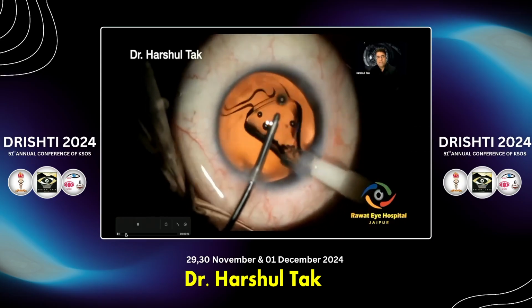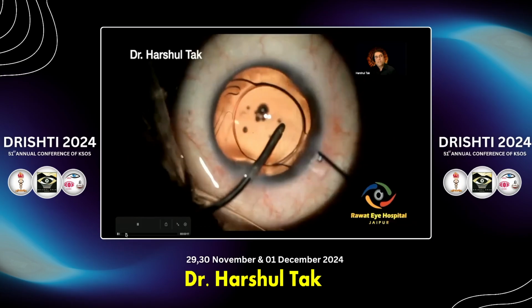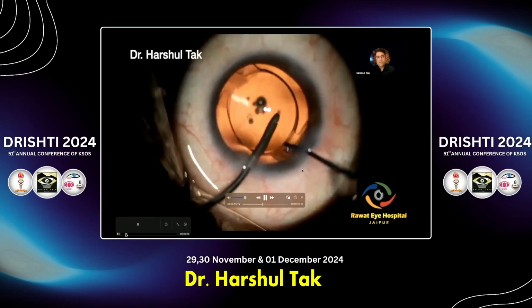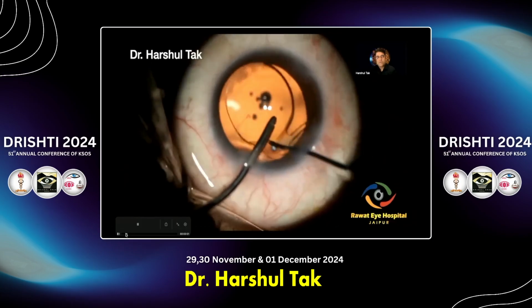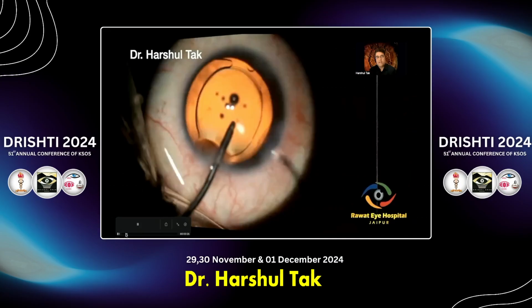And this is a hydroimplantation technique which I described in 2010. You just put the irrigation cannula in the anterior chamber and the single piece IOL goes in the capsule bag, and you don't need any OVD there.